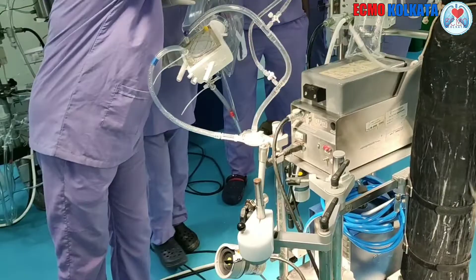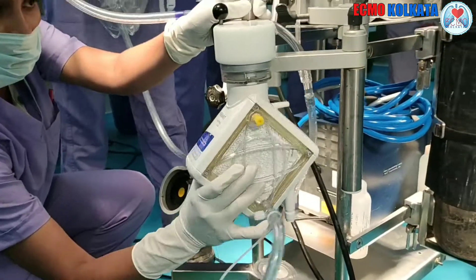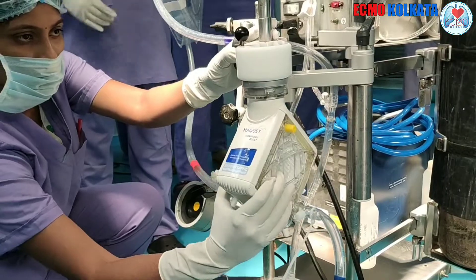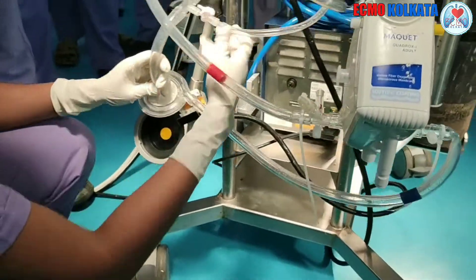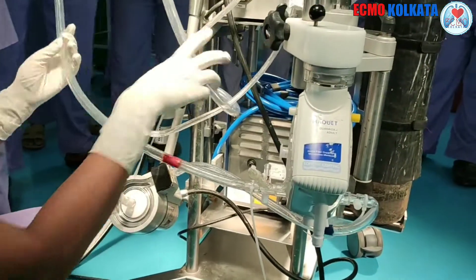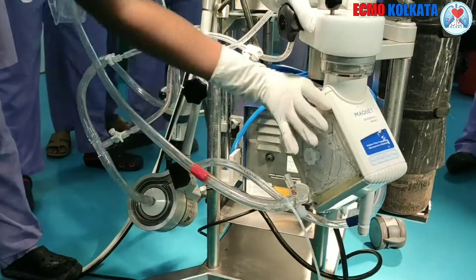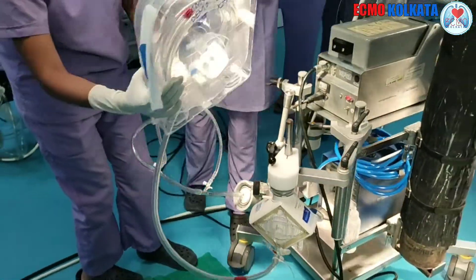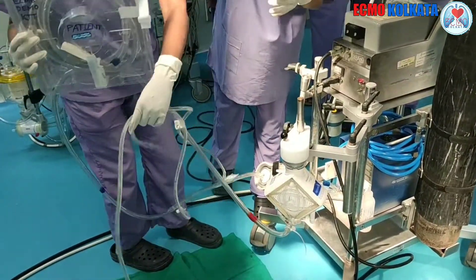First of all, we have to connect the oxygenator with its holder. It should be connected carefully. Next step is to connect the cone with the drive unit. It must be noted that there should not be any kink between the oxygenator and the drive unit. The remaining circuit is to be hanged so that the remaining work could be done without any problem.